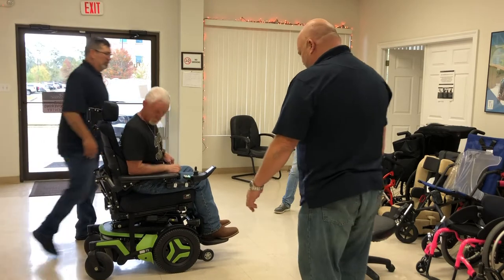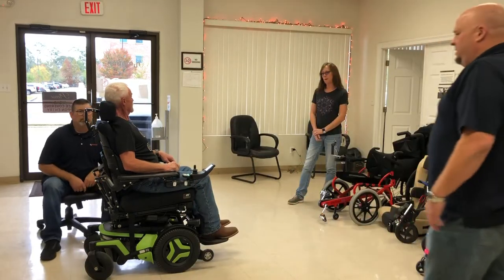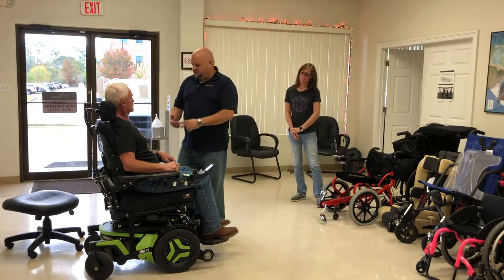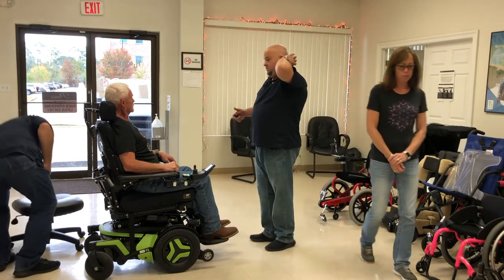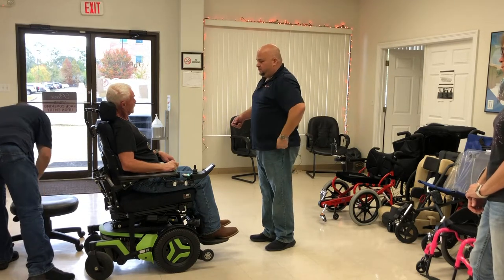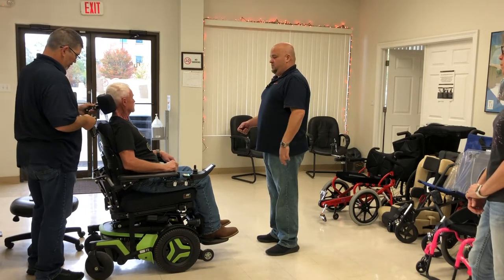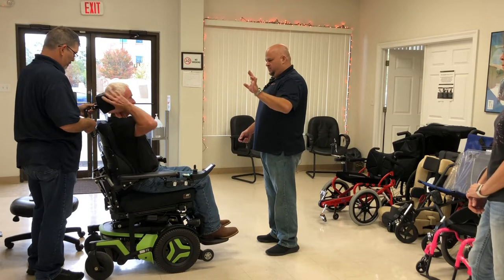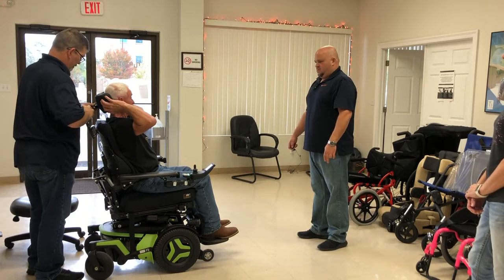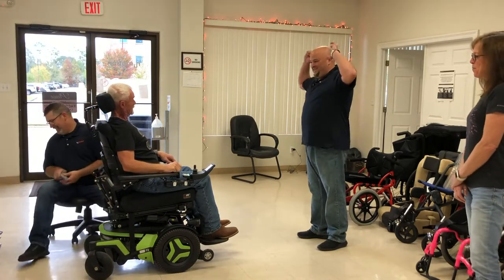How's that headrest? It's a little low, maybe needs to come up a bit. We want it at mid-head — not on your neck. We still want to capture a little bit of your neck to where it helps with swallowing and eating. So we'll loosen it and you tell us where you feel like it's good. We can move it back or forward — right there, that's good.